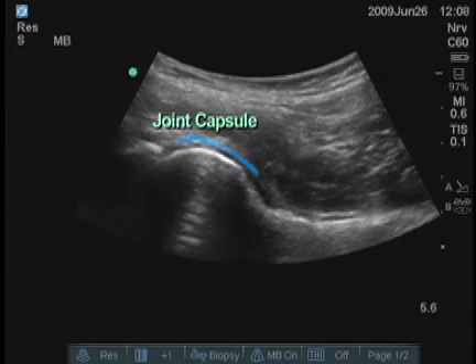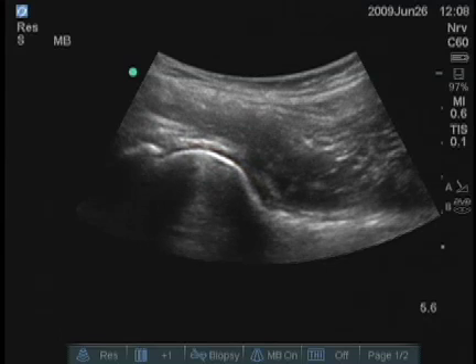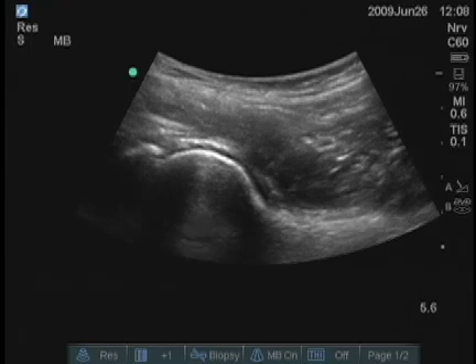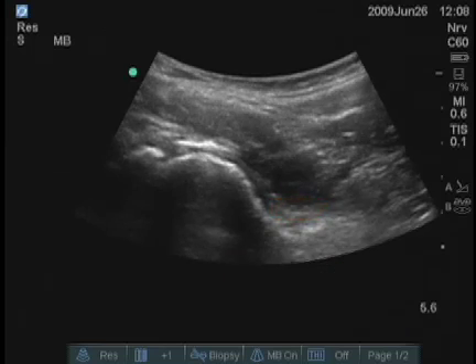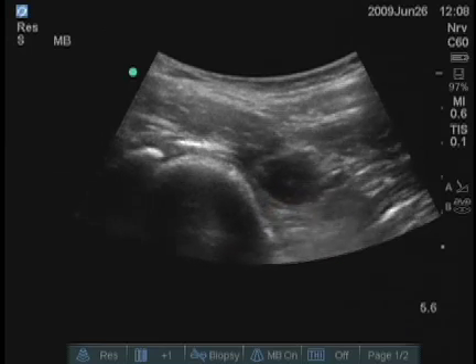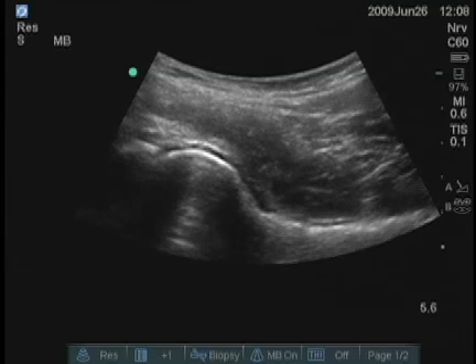You can even see the joint capsule and the cartilage on the femoral head, and in the corner where the neck joins the ball of the femur, you can see the femoral joint space. That area right there at the base is where you aim when you want to do an injection.